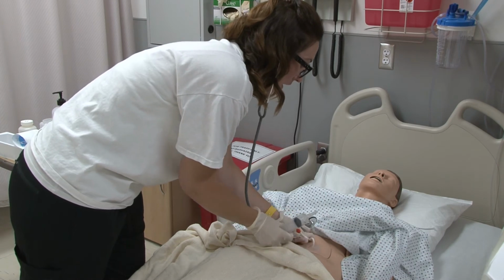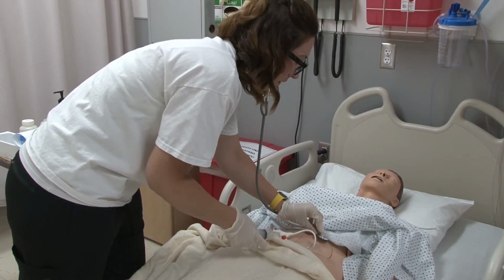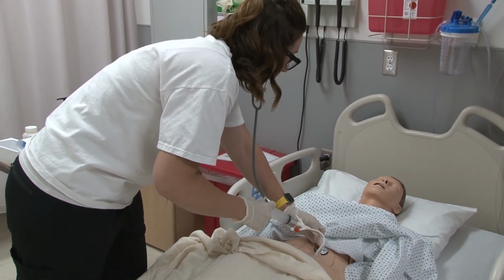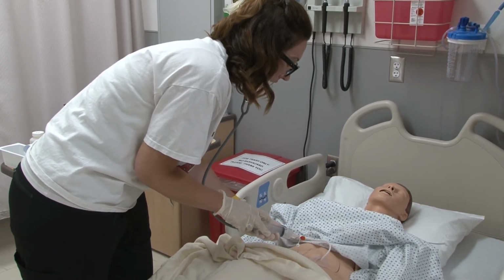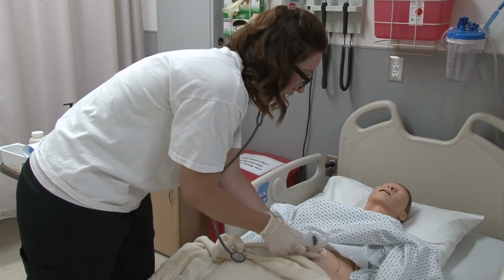Okay, I'm going to pinch it here. And I hear a gurgling sound. Very good, so I know it's in good place. I'm going to go ahead and pull back, and there's no residual. I'm going to go ahead and pinch it and close it.